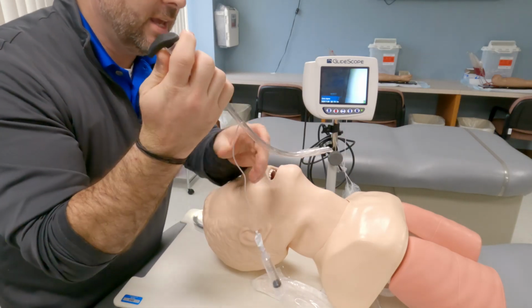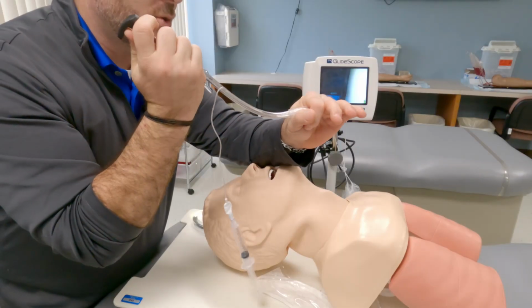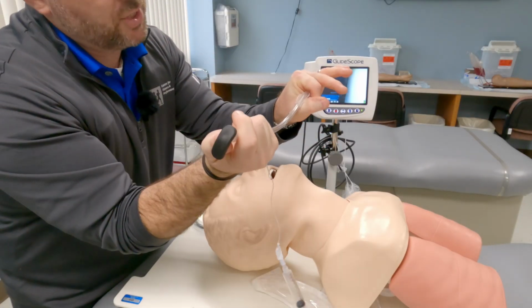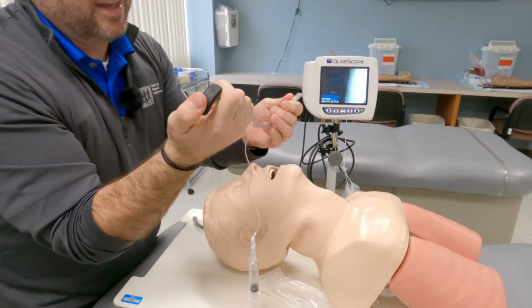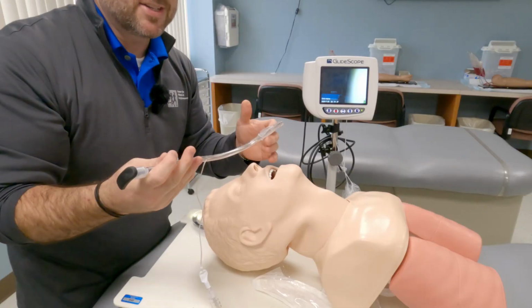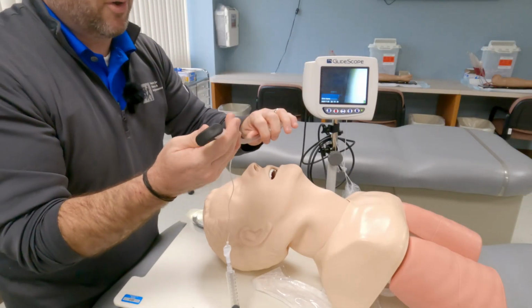So if this is in, right now you can see I don't have a lot of bend on it. So this goes inside the cords and it just kind of pushes. It actually pushes on the bottom aspect of the cords. And the more I push, the more it bends the stylet. That's how you know if somebody's using a glide scope and they don't know what they're doing, this thing is going to come out. Even a rigid stylet's going to bend in the wrong direction.